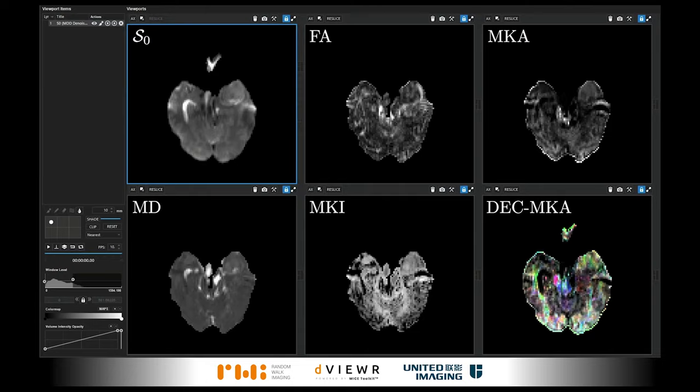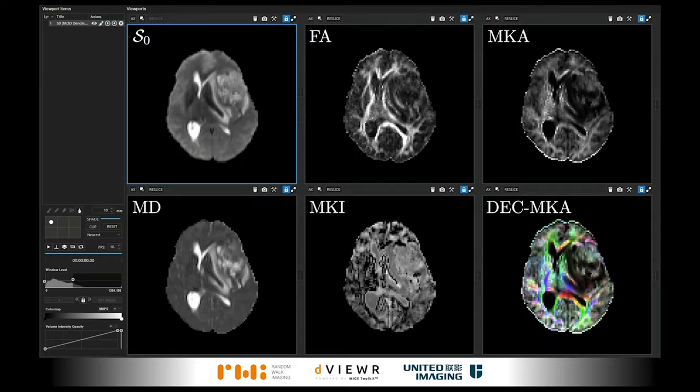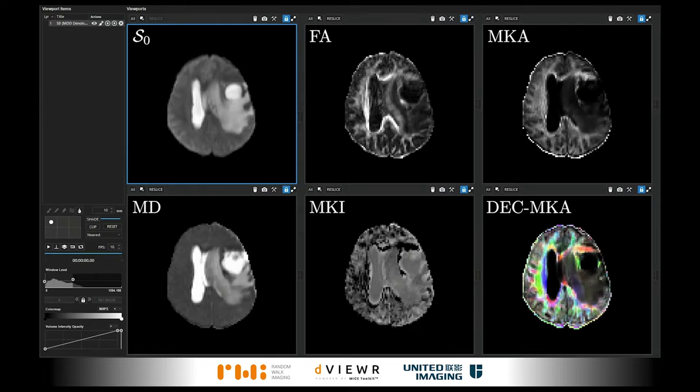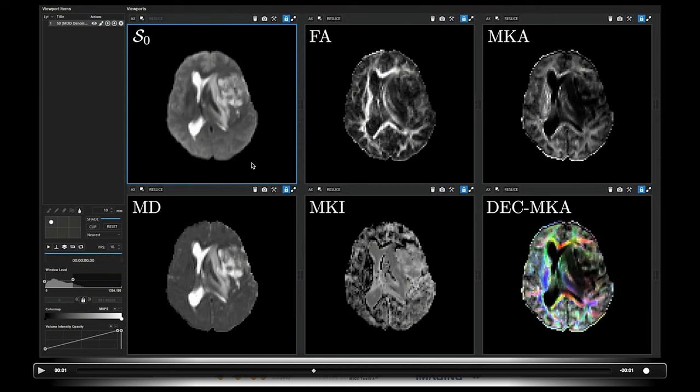These are typical QTI parameter maps estimated using our data analysis software Diviewer in a dataset obtained by United Imaging in China. This dataset features a grade 1 meningioma in the left temporal lobe. Here you see the S0 map, or the non-diffusion weighted signal; the mean diffusivity map; the fractional anisotropy map; and the isotropic and anisotropic mean kurtosis maps.